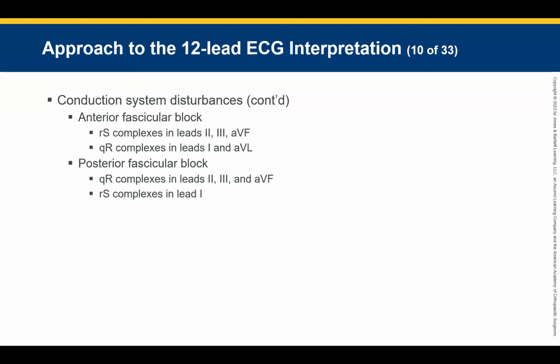And then my problem is, at least to me, he's already on the next part. I'm still trying to find the J point. I'm looking like, is the J point right here? Dude, I was looking at the T-wave, but he's like, point out the J point. And I'm sitting there and I'm stressed out. I'm like, I can't reach it. You tell me the window, you're looking over, okay, six.